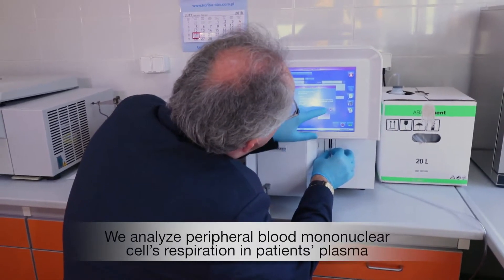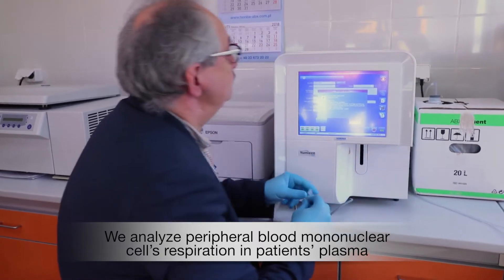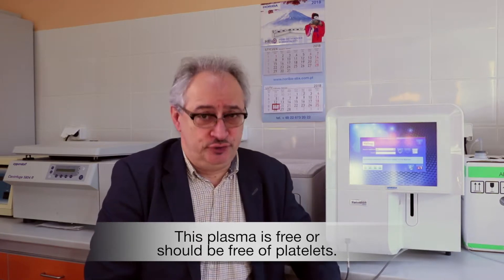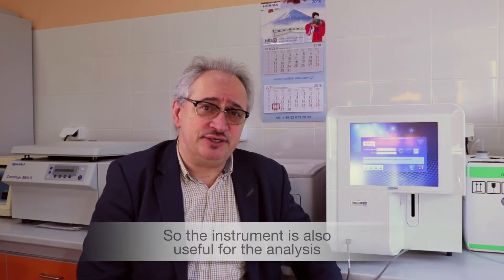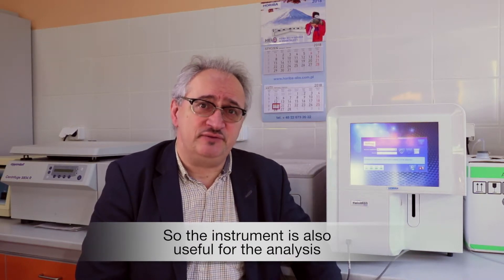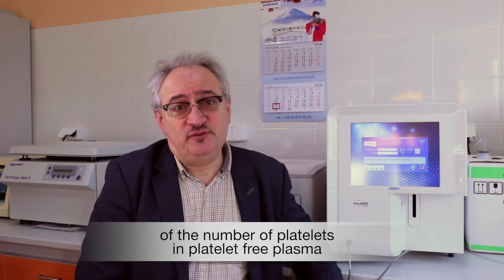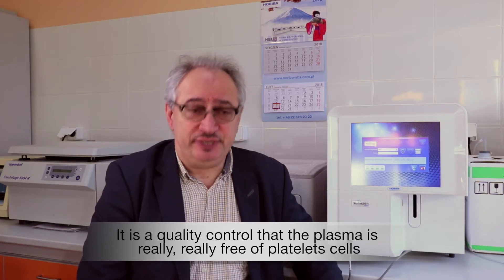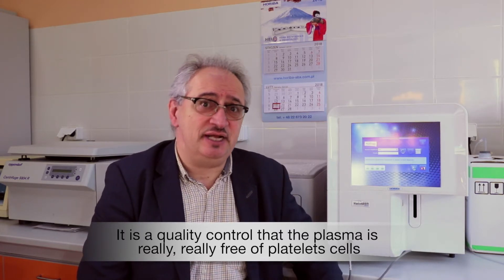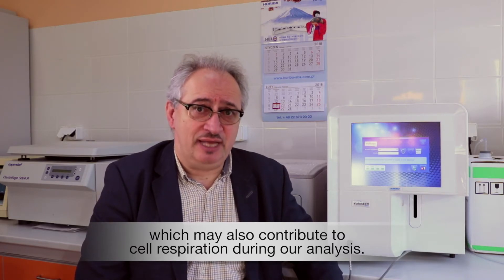We analyze peripheral blood mononuclear cell respiration in patient plasma. This plasma is free — or should be free — of platelets, so the analyzer is also used for the analysis of the number of platelets in platelet-free plasma. It is a quality control to ensure the plasma is really free of platelet cells, which may also contribute to cellular respiration during our analysis.